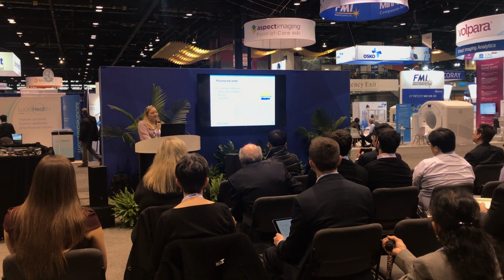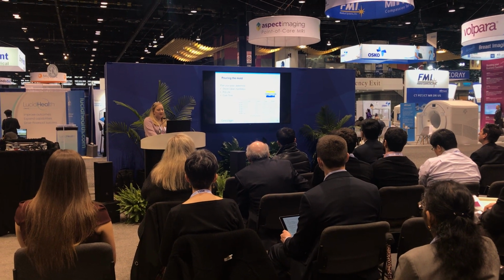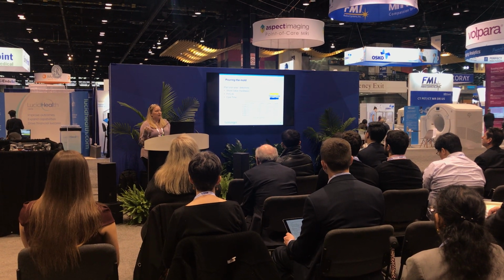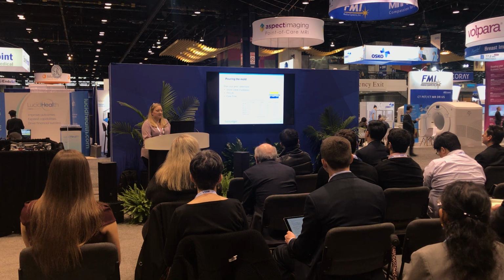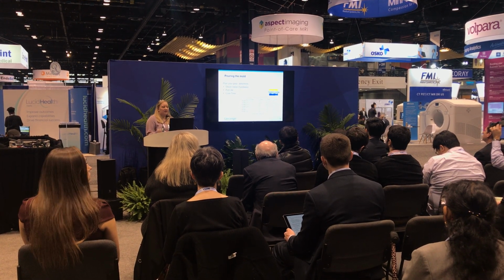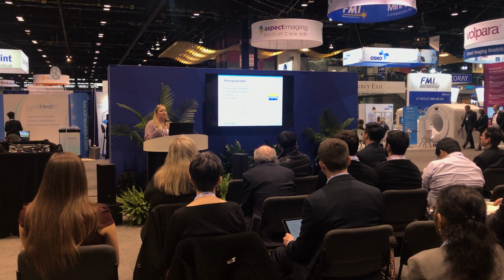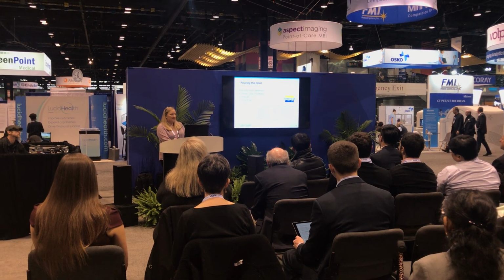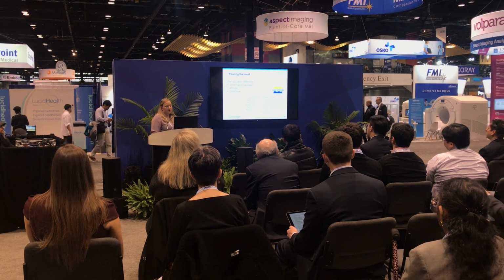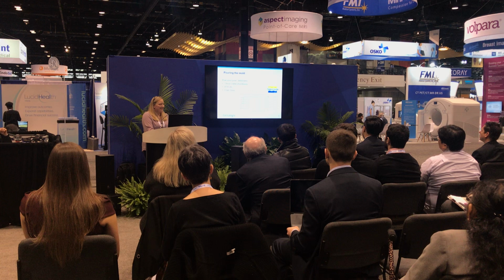So how do you plan your pour? We tend to use Smooth-On. It's just a really easy product, but there's three different things that you have to keep in mind when you're doing this. Shore value: how much do you want that silicone to flex, or how much do you not want it to flex. Pot life is how long you have to work with that silicone, and cure time is the amount of time before you completely remove that out of the mold. Once you figure out those three things, this is a really nice little chart here, then you just use whatever silicone it tells you.